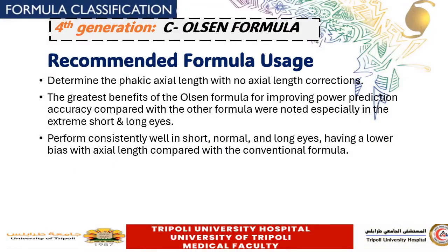Now, what's the recommended formula usage? The Olsen formula has been tried after many studies and has been applied for average sized eyes, small or short eyes, and long eyes, and it shows very useful, very predictive results with high accuracy in all ranges of eye sizes.